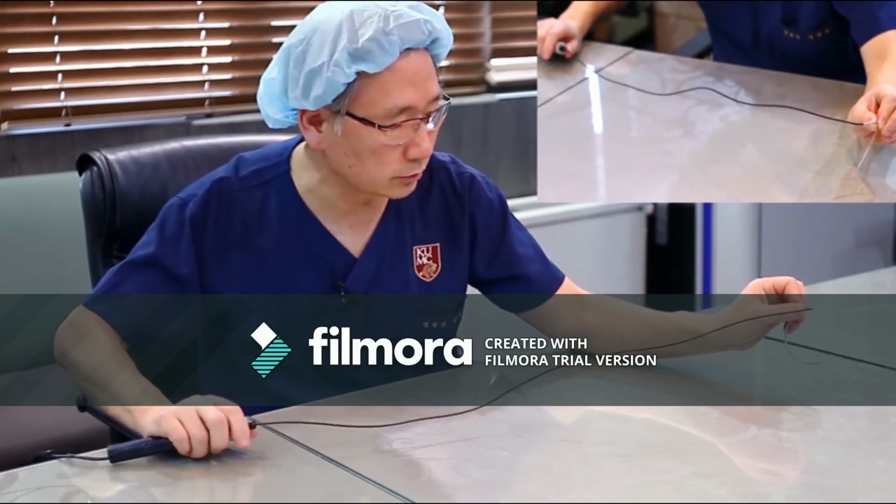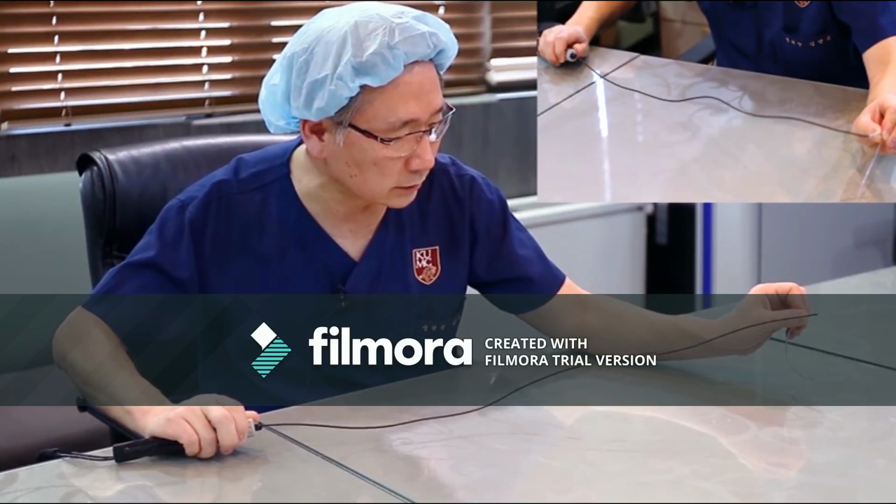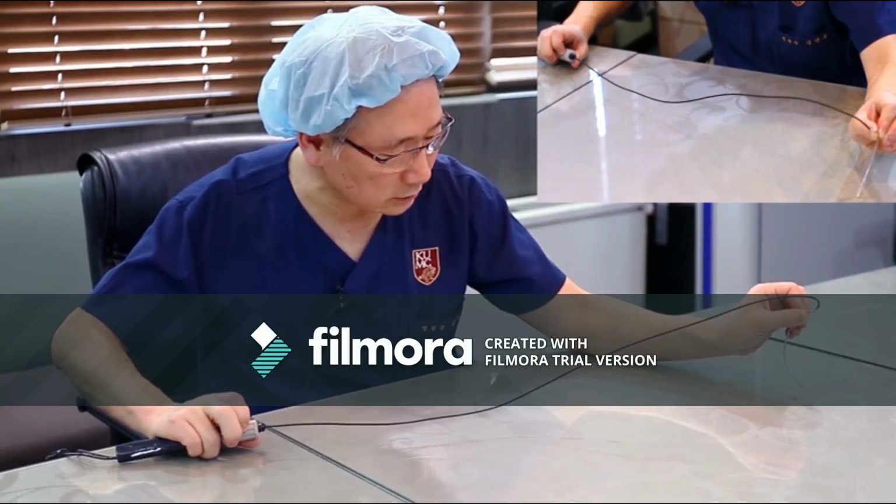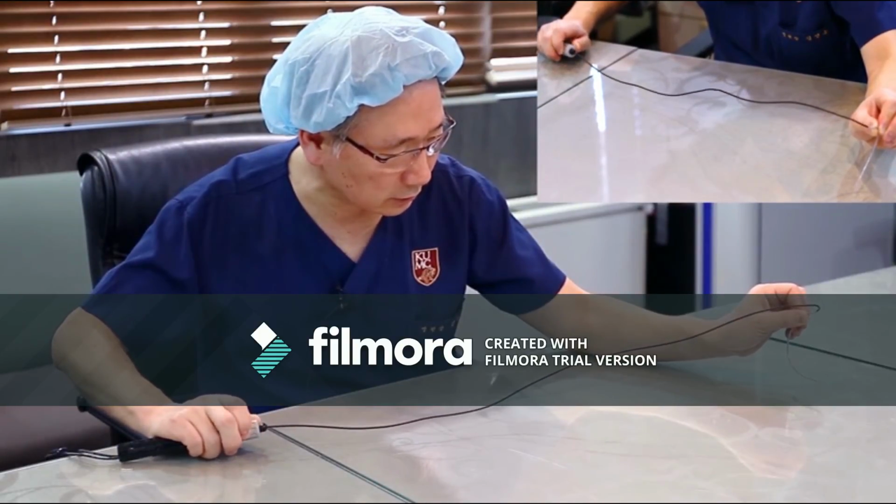Once you confirm, for example, sometimes you need to adjust by relaxing the deflection a little bit more.